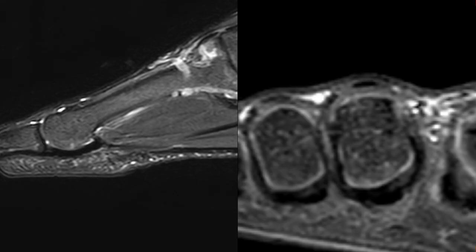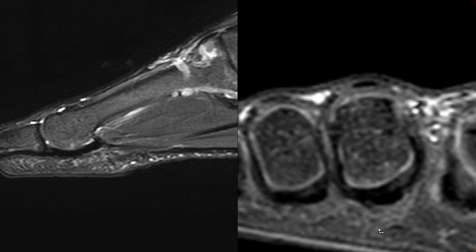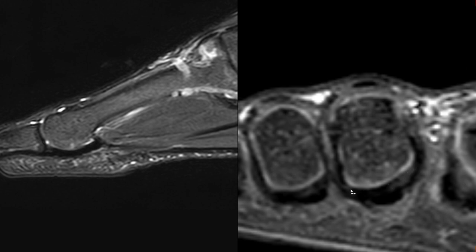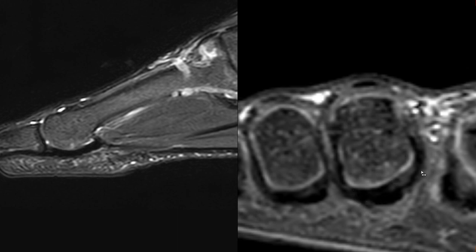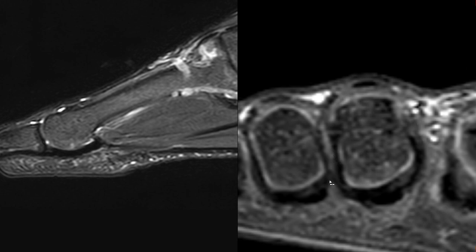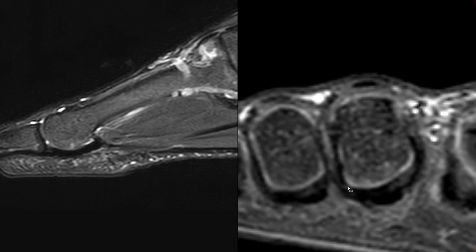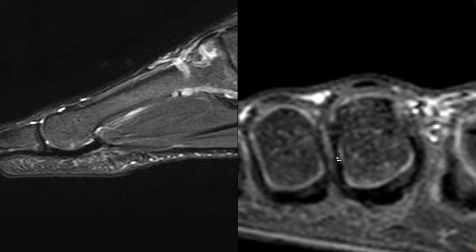The best sequences to assess the plantar plate of the lesser metatarsophalangeal joint are sagittal views and axial views of the forefoot. At the level of the metatarsal head there is a black structure or low signal intensity structure between the flexor tendons and the metatarsal head — this is the plantar plate. On the axial view you have this U-shaped form, with the plantar plate here and these black structures on both sides being your accessory collateral ligaments, and the most upper portion being the proper collateral ligament.